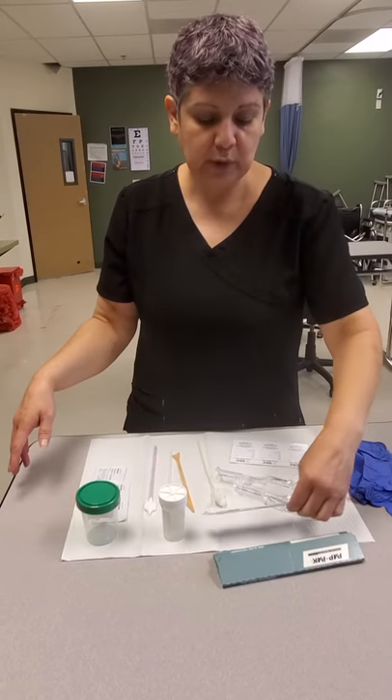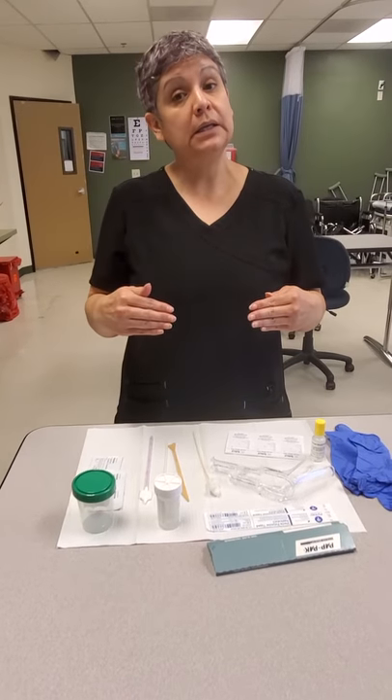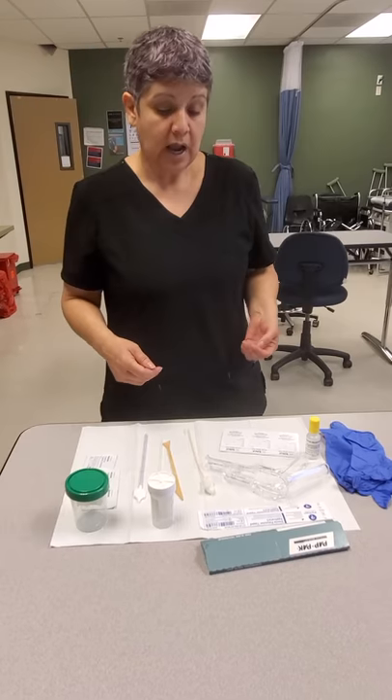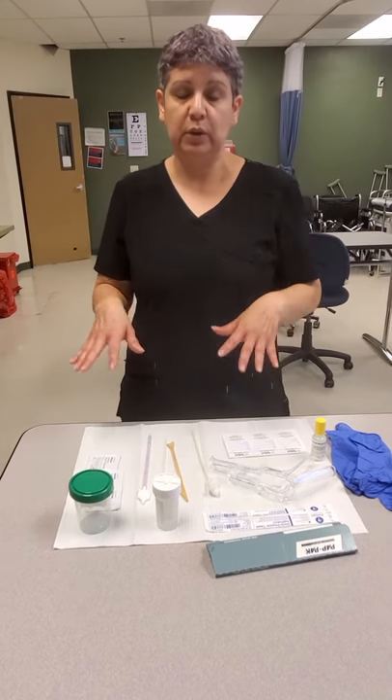Okay class, today I'm going to show you a pap smear tray set up, even though it is on the table. I'm just going to give you information on the equipment needed, or what we usually need — the basics for a pap smear when we are assisting the provider. I'm going to go through and tell you what each piece of equipment is and then explain how and what they're used for.